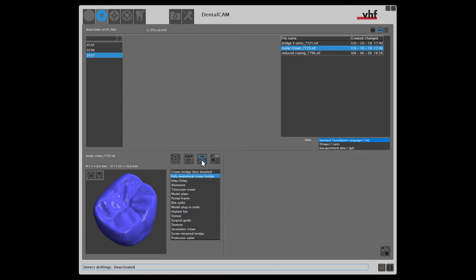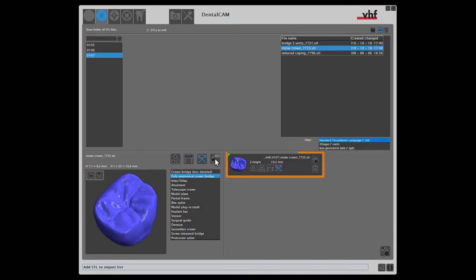When all calculation options have been specified, you can add the STL to the import list. Your STL now appears on the import list.